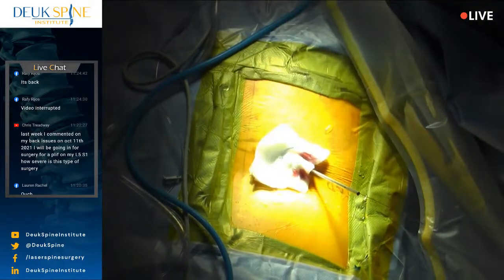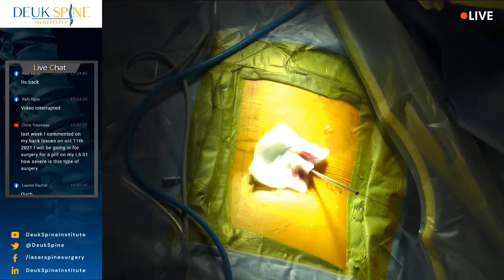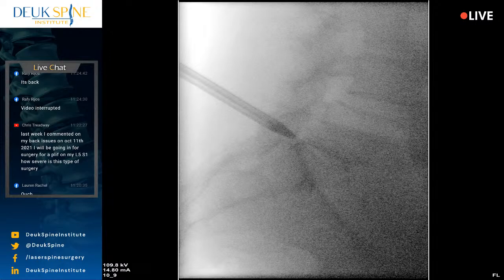All right, lateral. So we're basically making our way down to that herniation at L5-S1, following the guide wire. And you can see the guide wire is coming out the back end of this dilator, okay? So we are now in the foramen. I can feel the herniation.